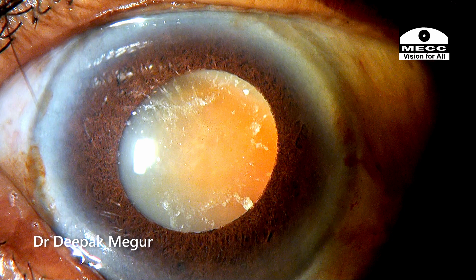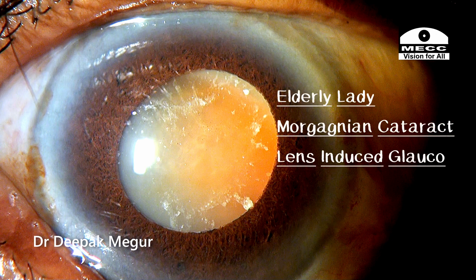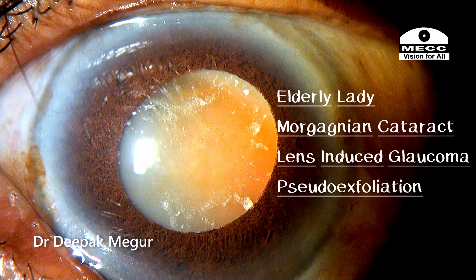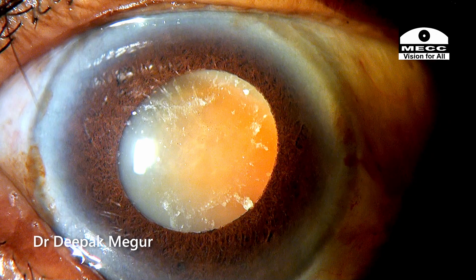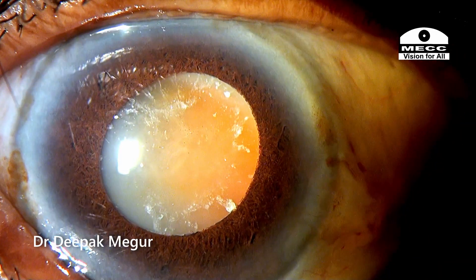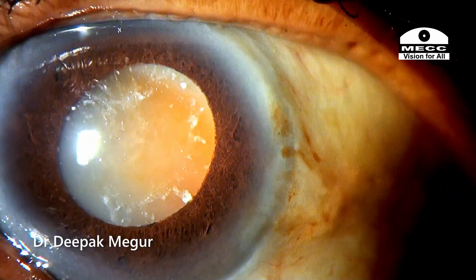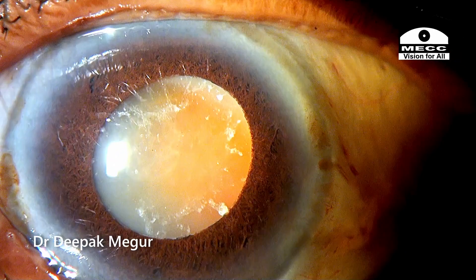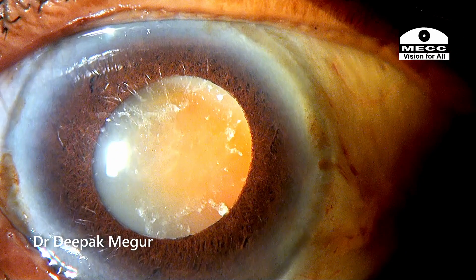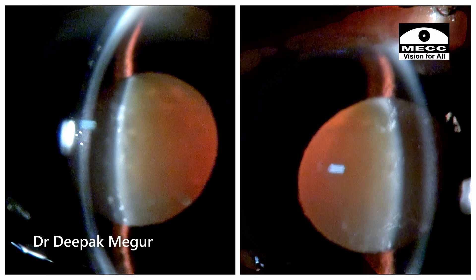Hi, today I am presenting this elderly lady with the Morgagnian cataract and she has lens-induced glaucoma. She has been symptomatic with severe pain and redness for the last 10 days. After a couple of days of medications to reduce the intraocular pressure and inflammation, the patient is scheduled for surgery.